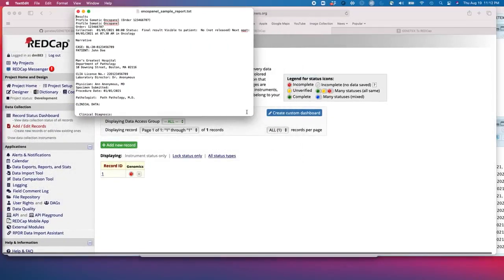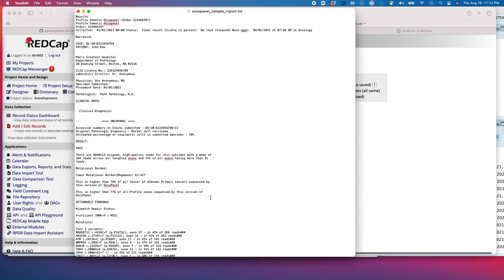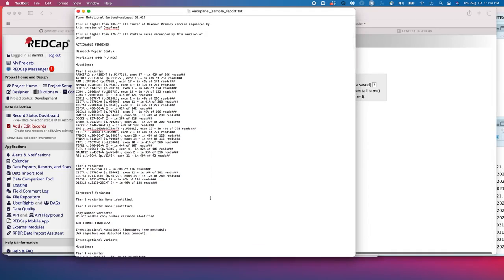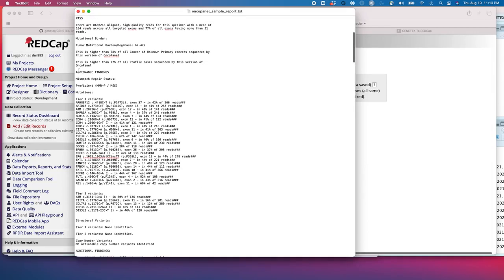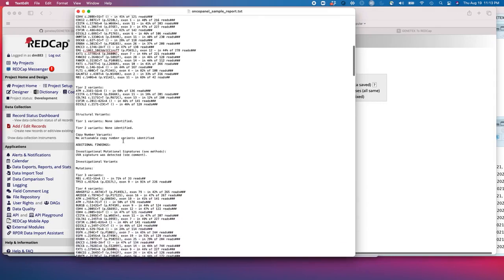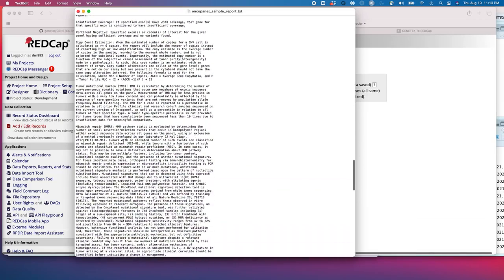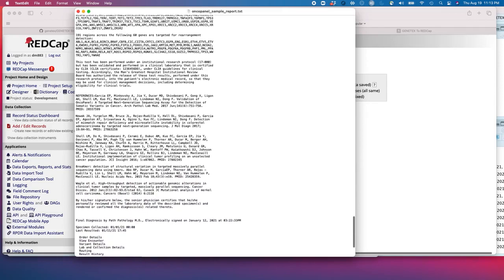This is genetic analysis on a primary tumor from a Merkel cell carcinoma patient. Of note, this is a fictionalized, synthetic patient — there is no actual patient-protected health information here. But this is a good example of the data that might be contained in an oncopanel report. We have a series of information that would be desirable to capture: a number of actionable findings such as tumor mutation burden, mismatch repair status, as well as a number of genetic variants found in this tumor. There's a lot of data here, including data that is extraneous and data that we do want to capture.